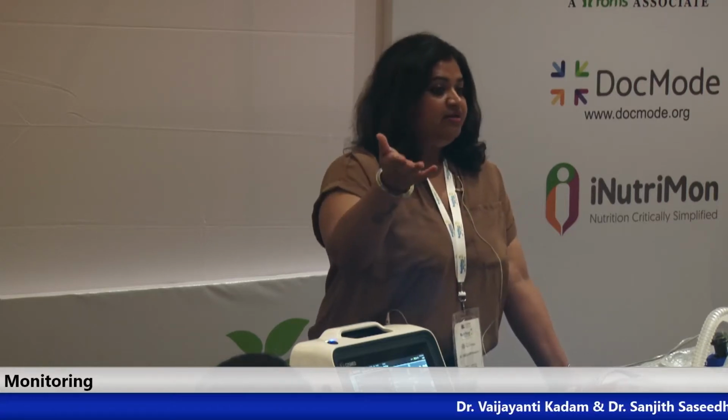See, again, what she just mentioned is we do not know the exact weight of the patient who is lying down on a bed, isn't it? All the more difficult to understand how much is the calorie requirements, and then what you're doing? Just approximating the previous weight of the patient.